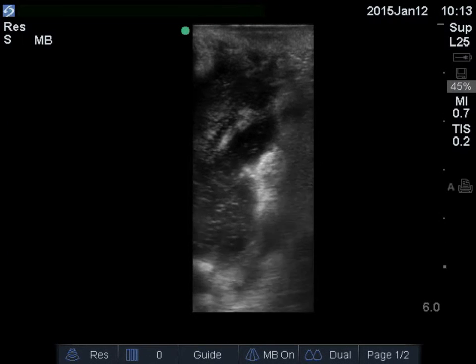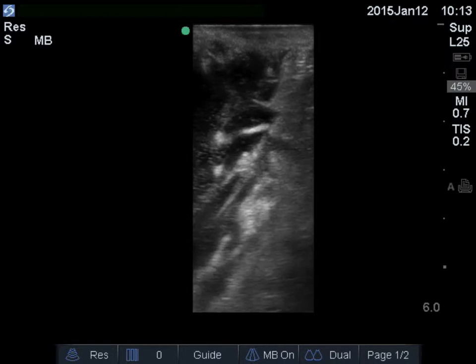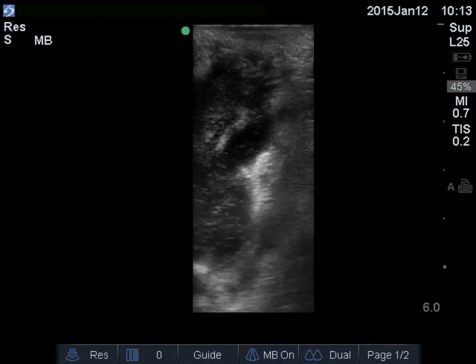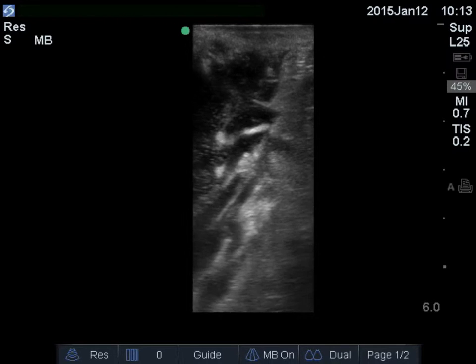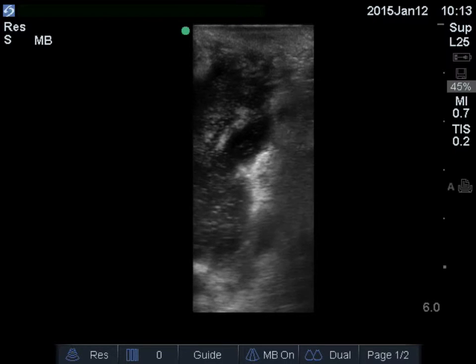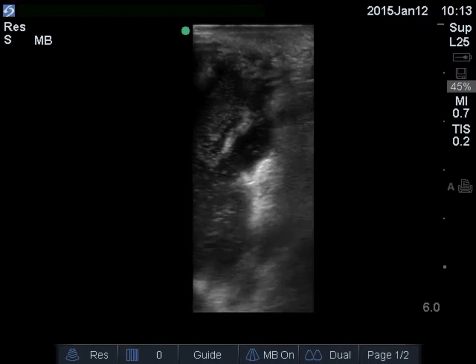And last one, what do you think? This is again a fairly young man who is a little overweight who comes in with swelling to the inner aspect of one buttock. It is tender, warm to touch, but you can't appreciate any fluctuance on your physical exam. Based on this clip alone, do you think this is an abscess?